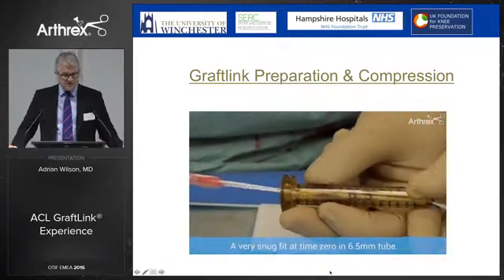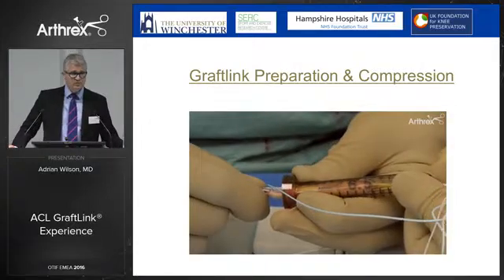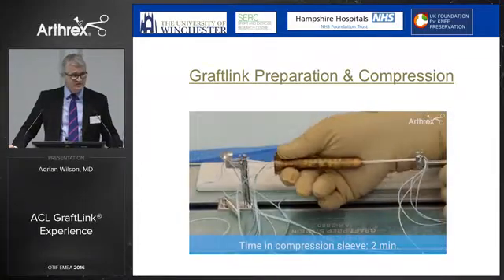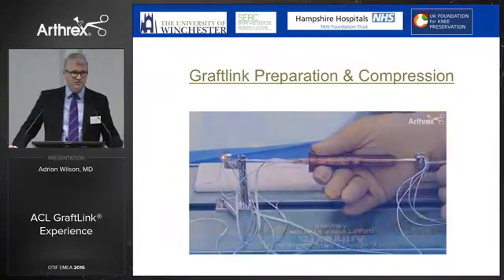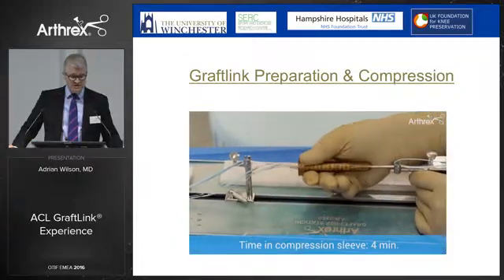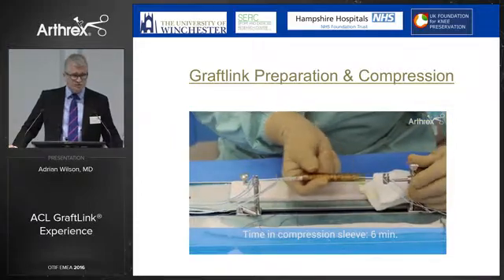Into the compression sleeve, we're initially size 7, fairly tight, and then we pull into this second compression sleeve, and what we find is with autografts we can downsize by half a size pretty much every case. With allografts it's almost as much as 2 sizes. So it's amazing how you can then make a smaller tunnel because you're using a smaller drill or smaller flip cutter for the case.